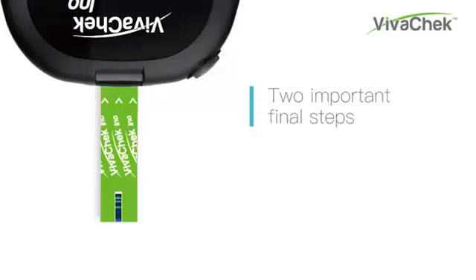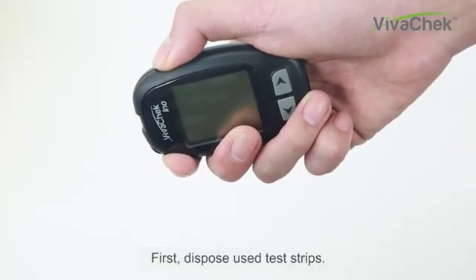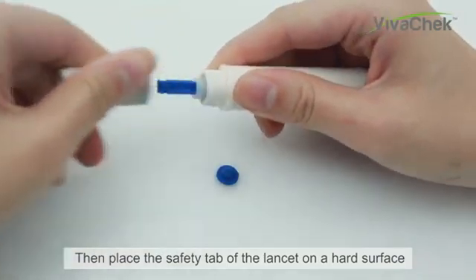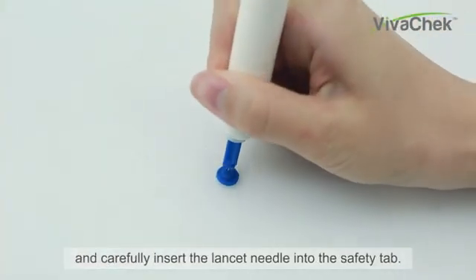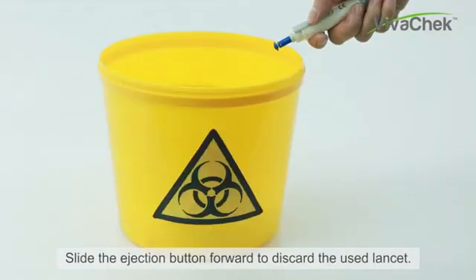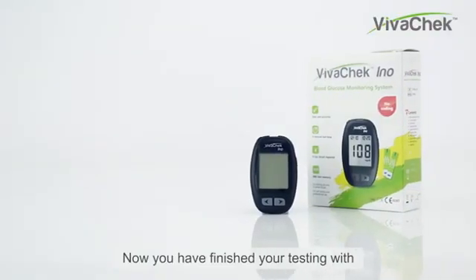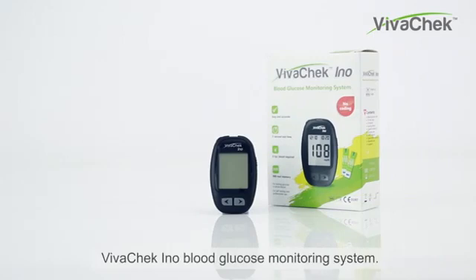Two important final steps. First, dispose of the used test strip. Then, place the safety tab of the lancet on a hard surface and carefully insert the lancet needle into the safety tab. Slide the ejection button forward to discard the used lancet. You have finished your testing with the VivoCheck Inno blood glucose monitoring system.